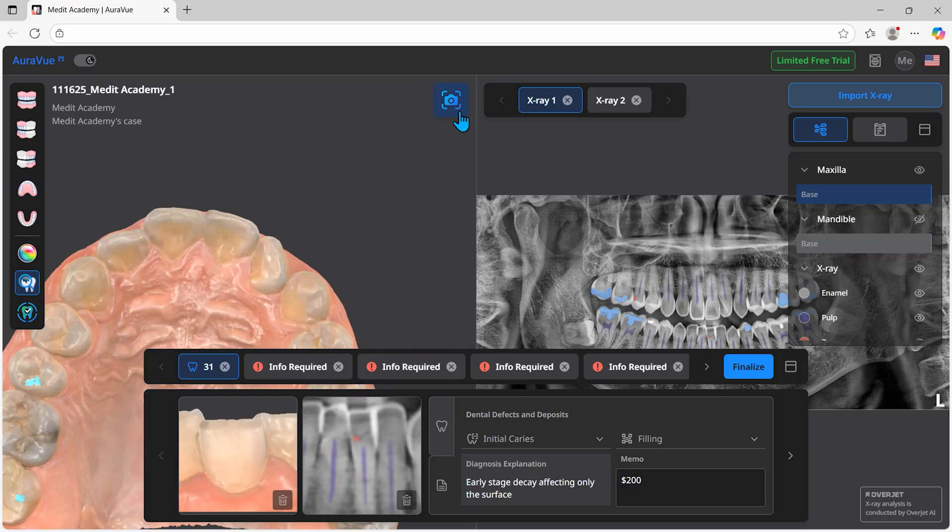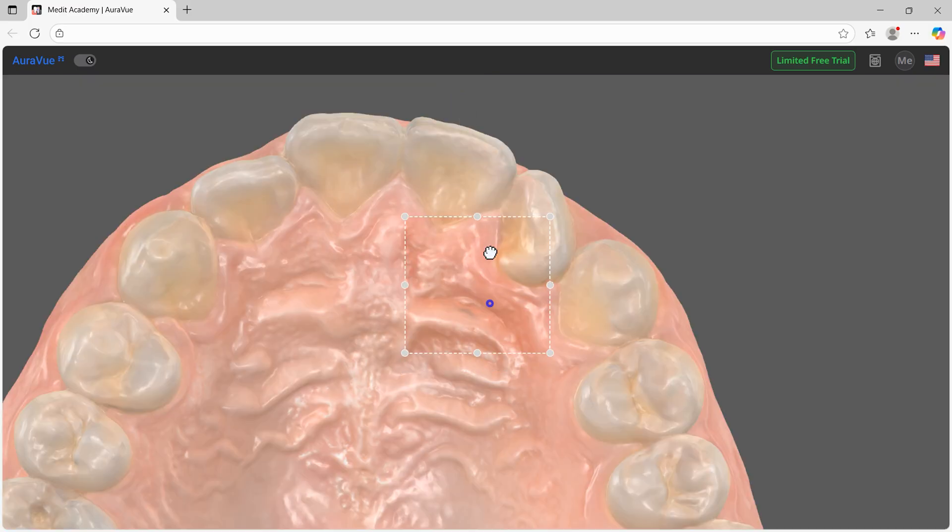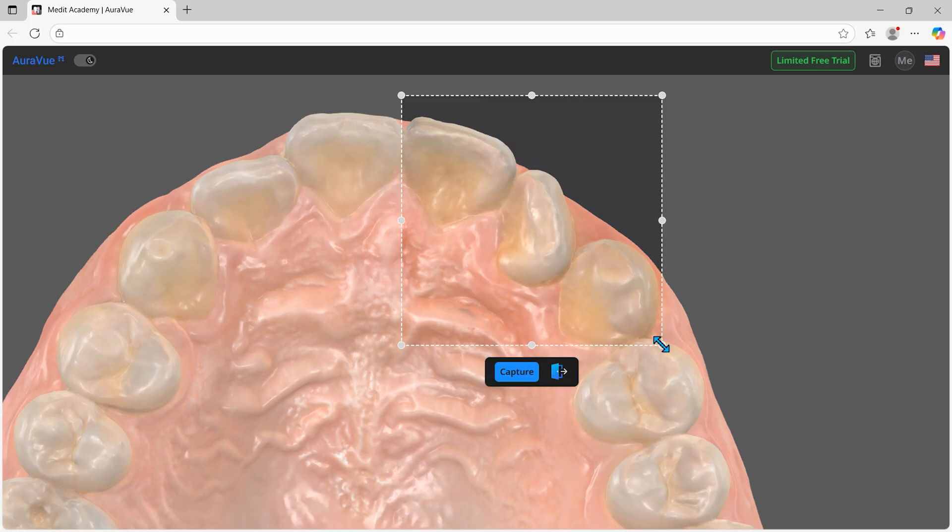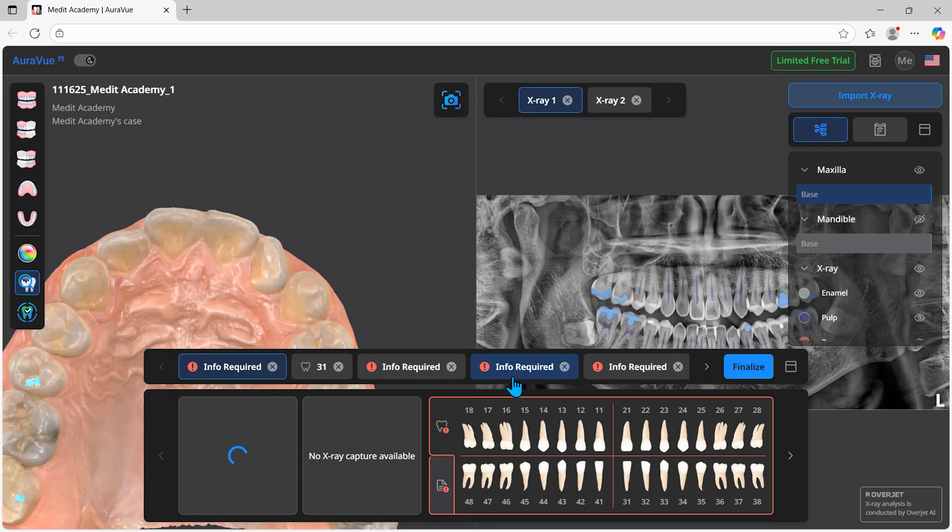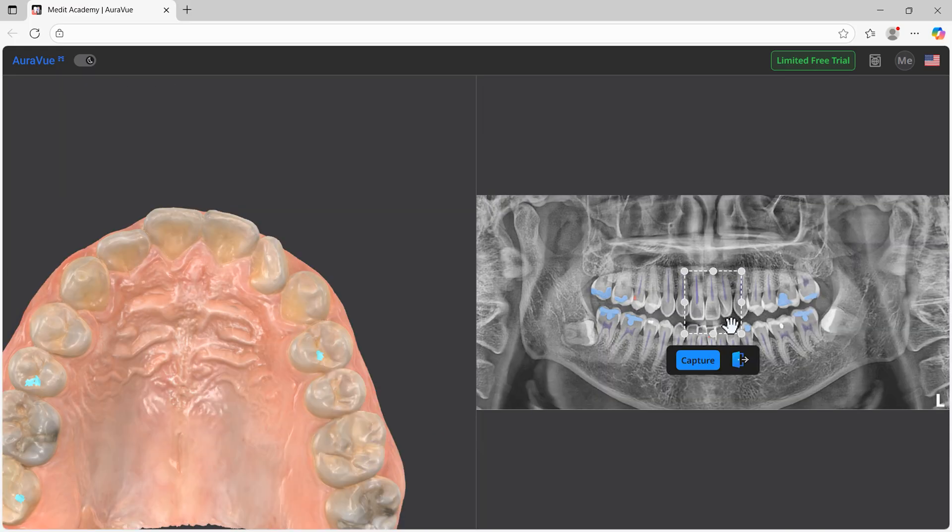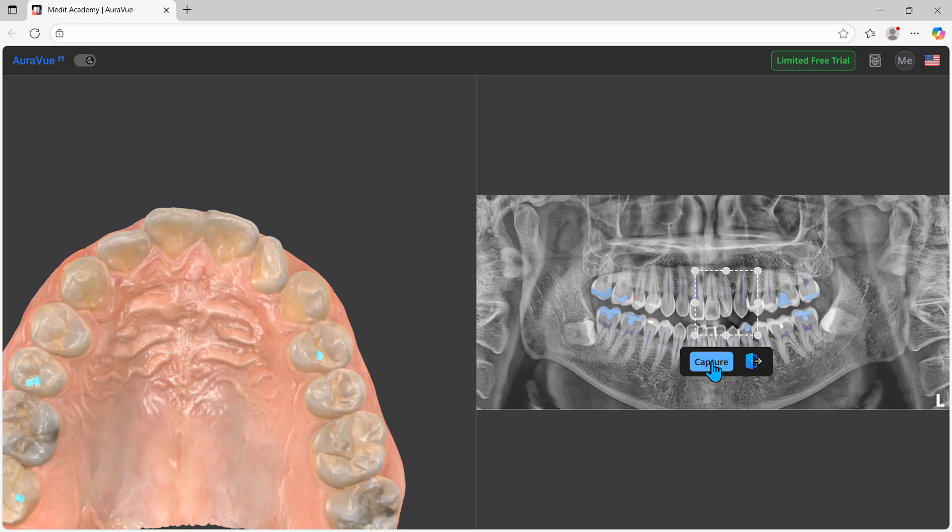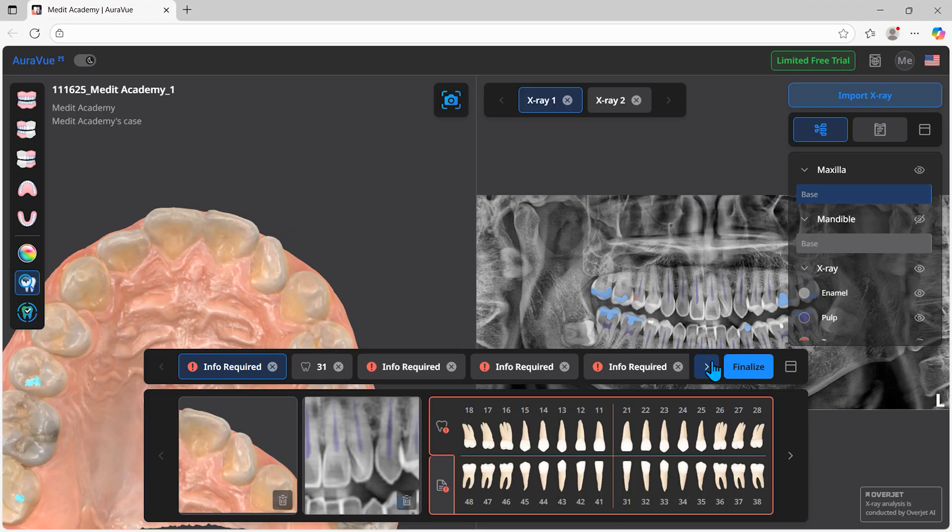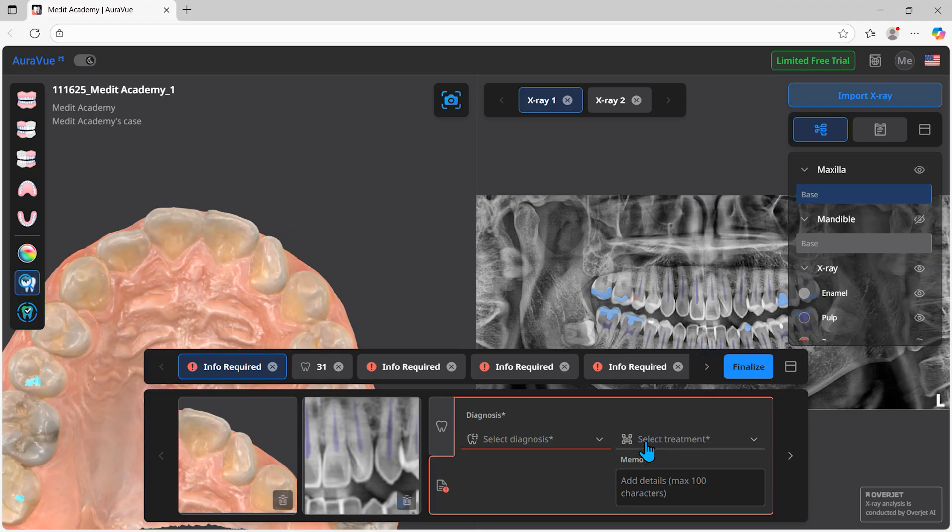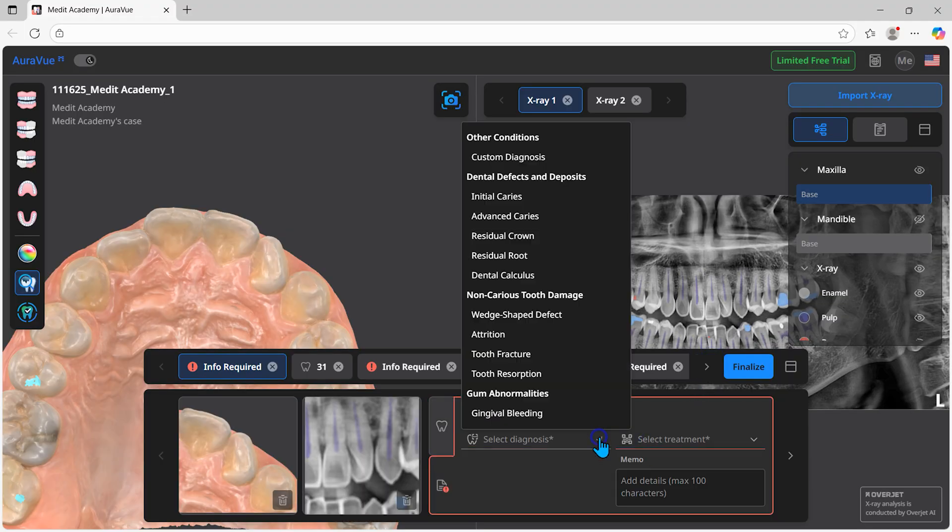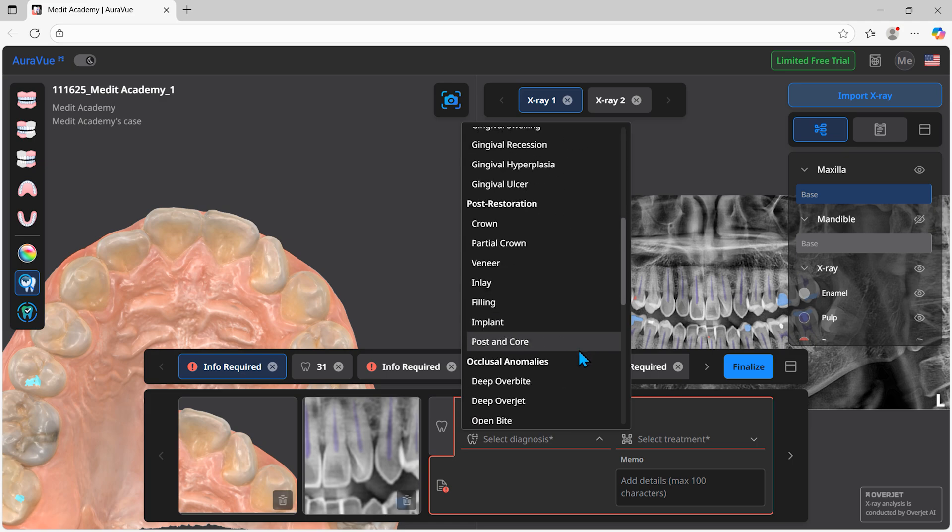Capture areas of concern on the scan data and radiograph images. Repeat the process to create reports for all of the patient's areas of concern.